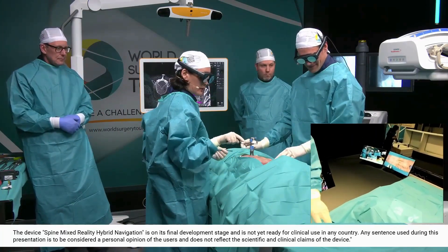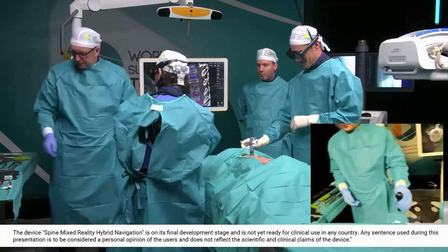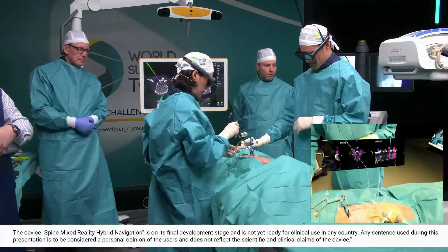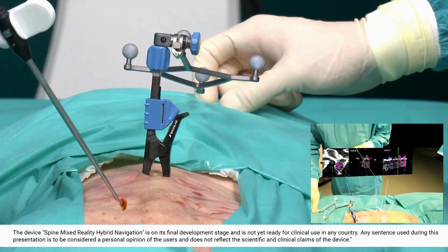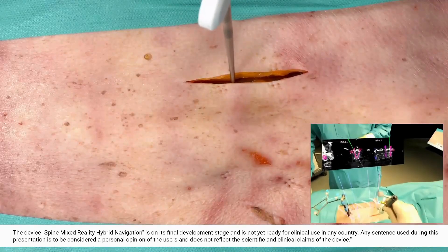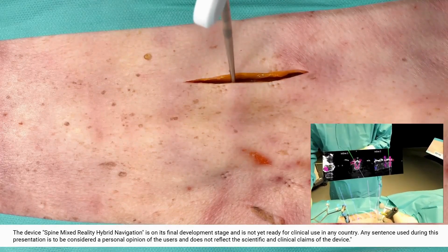If I press here — can you see that? If I press here and I use this pointer, can you show me the pointer? The place where I place the pointer, you can see that I can see the skin and the overlaid image is not visible. This is something that you can also use for the skin incision and also for placement of the pedicle screw.